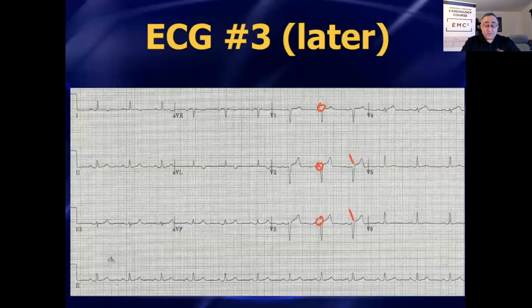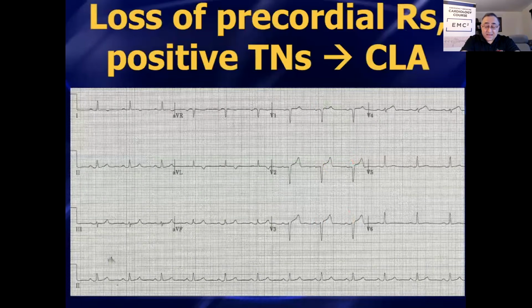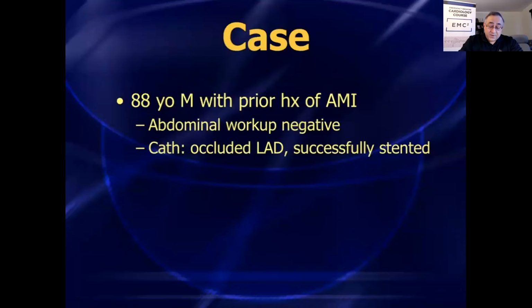So at this point, they're finally able to get the patient to the cath lab, but not until after the patient has already lost their R waves, developed Q waves, and the patient had an occluded LAD. Fortunately, ended up doing okay.